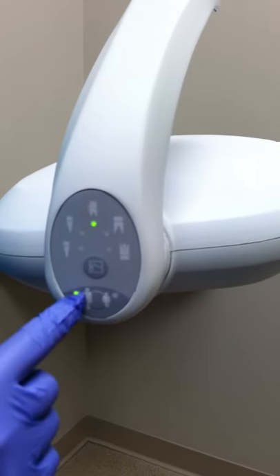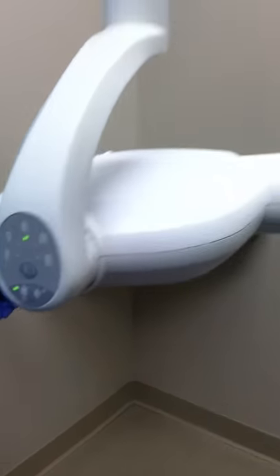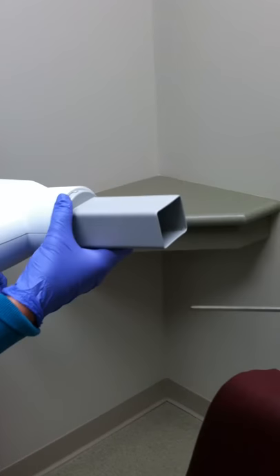Make sure the settings are on the bite wing button and on either child or adult setting. Place the rectangular collimation so that it is horizontal.